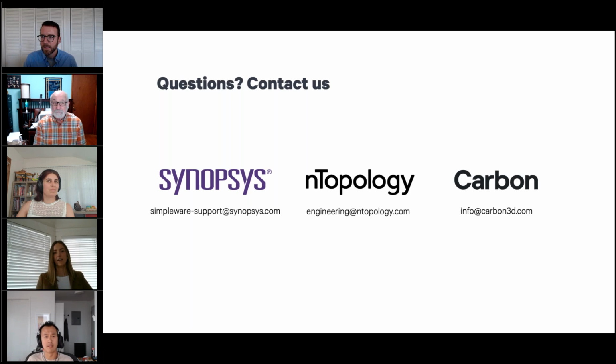I would parrot a lot of what Stephen is saying. From being in the middle, upstream of manufacturing, downstream of the patient scan data, the process as a whole was fairly seamless on my part, and I can't imagine any logistical obstacles to getting this implemented on site at a patient care location. I think the only real obstacle is figuring out the best way to get through regulatory, get through that validation process, to close the threads there.